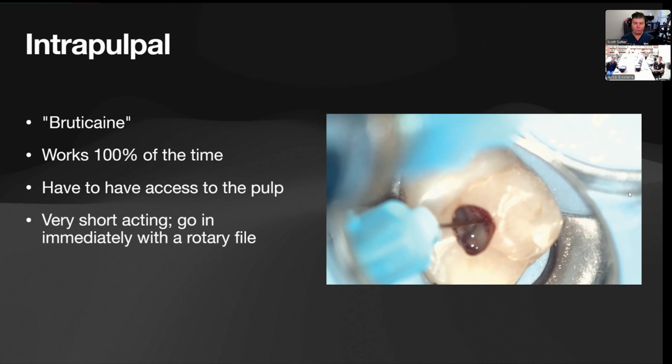So when we're going to give an intrapulpal, we warn the patient, you're going to feel a lot of pressure, then you're not going to feel anything. I do apologize. This is the best way to, you can say your nerve is really upset. I usually use an analogy of your tooth is really inflamed, which means there's a lot of pressure and bleeding. It's literally pushing the anesthetic out of the area. We know that's not the case, but patients kind of understand that, and then I have to go right back in there, and then we'll get the nerve out. Once you get the nerve out, they usually don't feel anything the rest of the time, and it's interesting. On multi-rooted teeth, it's usually just one of the canals. That's the problem. I find that it's whatever, like, if the caries is closer to the mesial, it tends to be the mesials that are the problem.